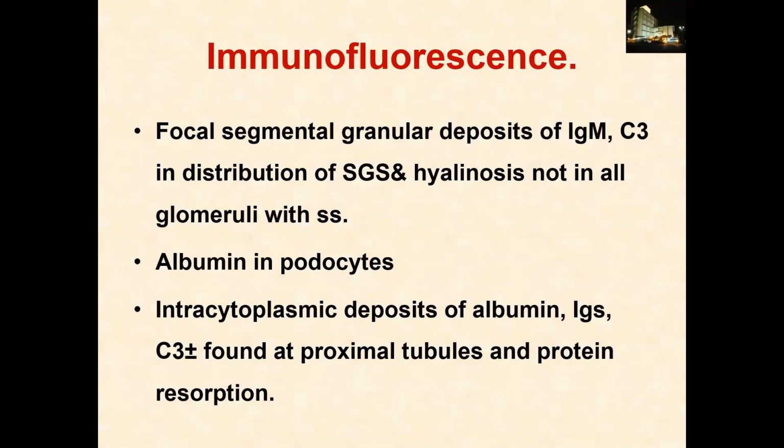Immunofluorescence. Also in focal segmental glomerulosclerosis, the immunofluorescence is not significant. A few cases may exhibit segmental granular deposit of IgM or C3 in the distribution of the segmental sclerotic segment or hyalinosis.